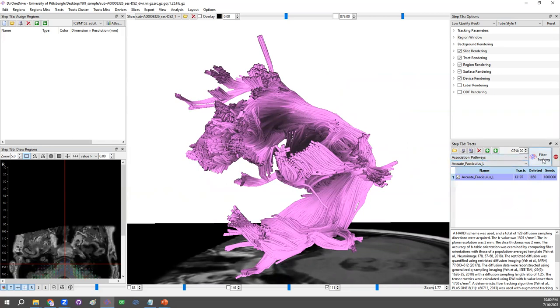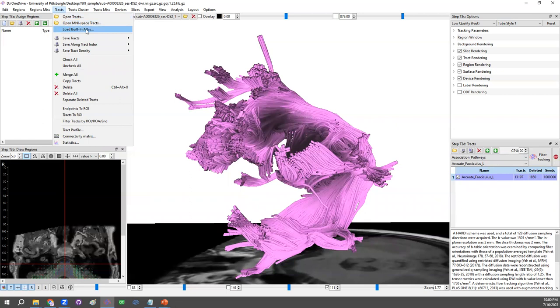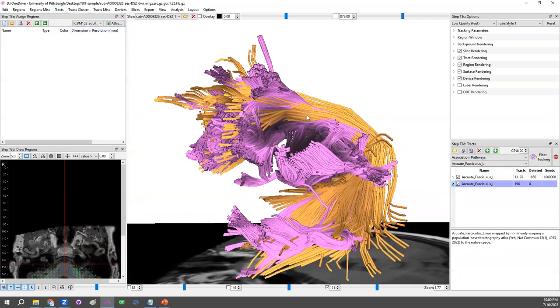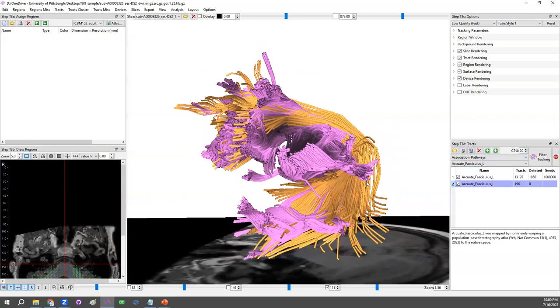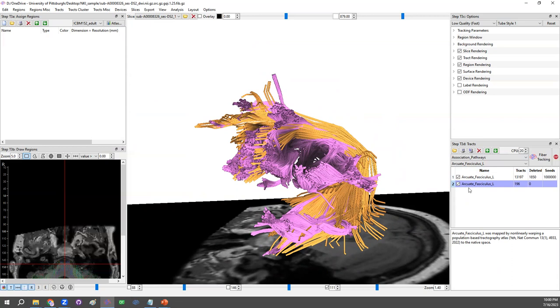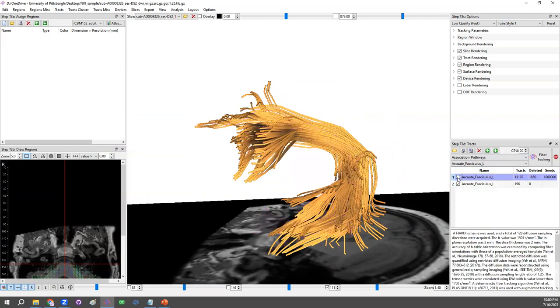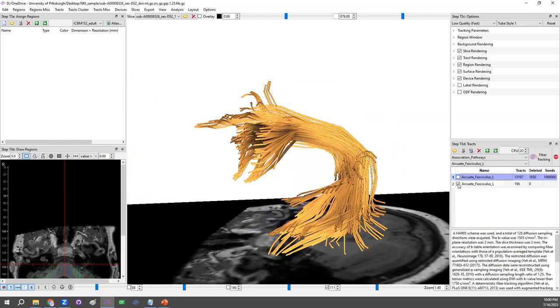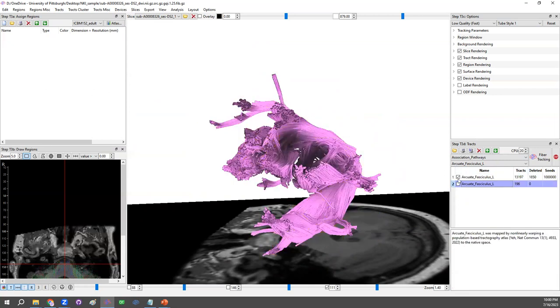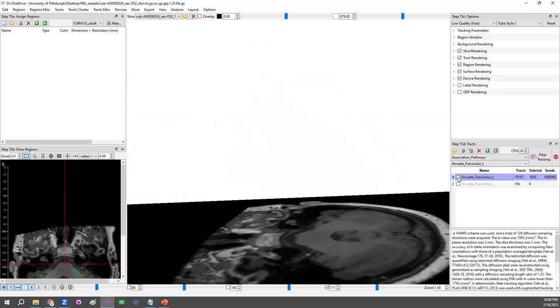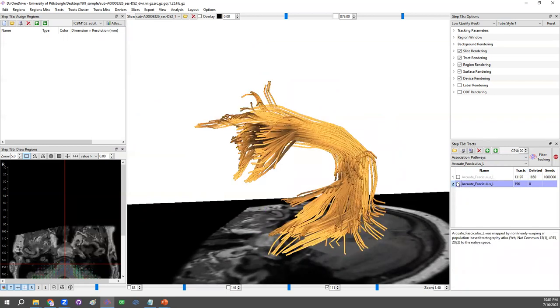So the way to do it, let's go back to the arcuate fasciculus. Instead of clicking on the fiber tracking button, we go to the top menu. Under the tracks menu, we could load the built-in atlas. Click on it. Then DSI Studio will bring in how the group average looks like in this native space. So what DSI Studio is doing here is spatially transformed the built-in tractography atlas into the native space. So we could see their difference in terms of individual mapping and also the group average. So this one is individual mapping and this is group average.